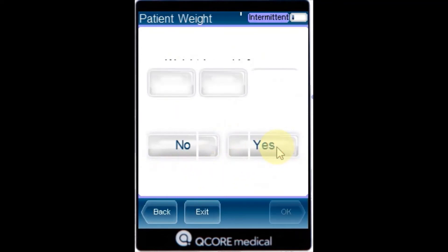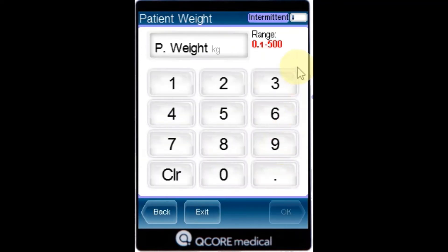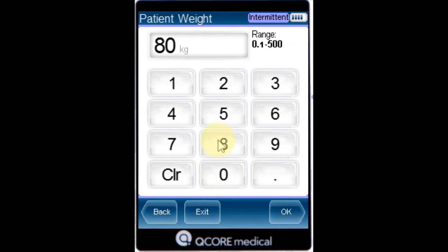Press yes. From the patient weight screen, using the keypad, enter the patient weight and then press OK.